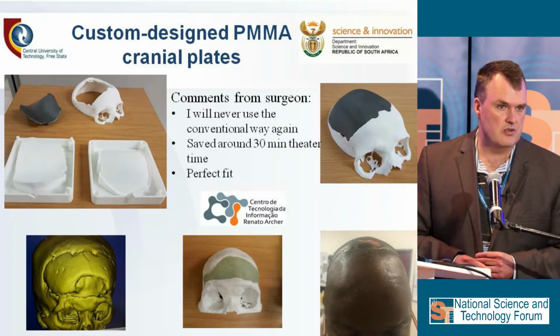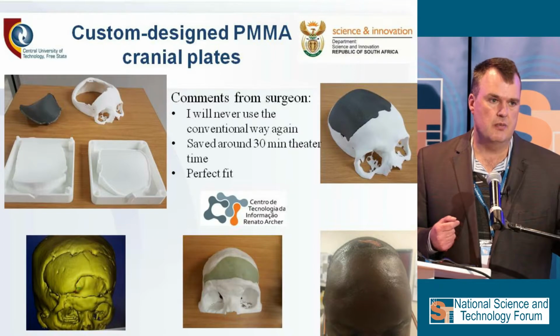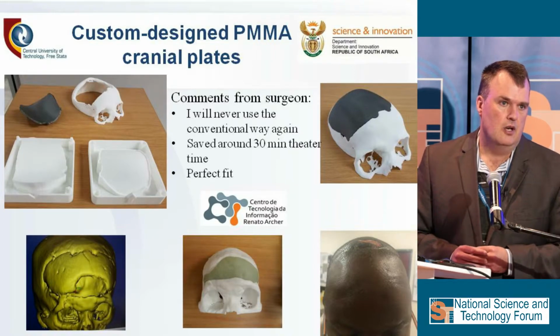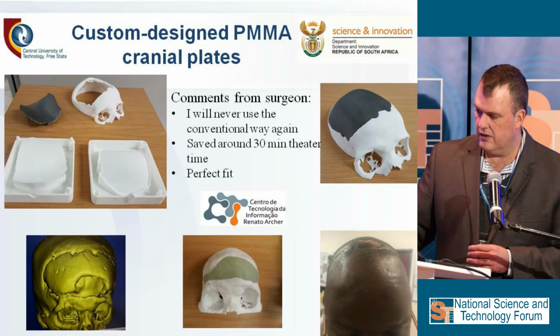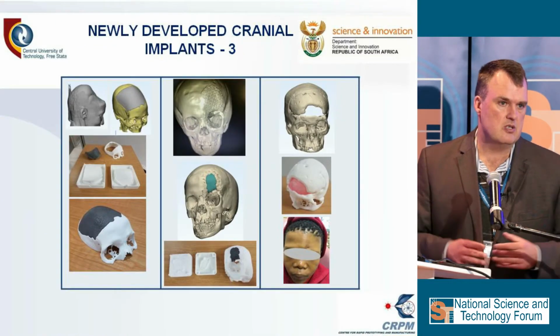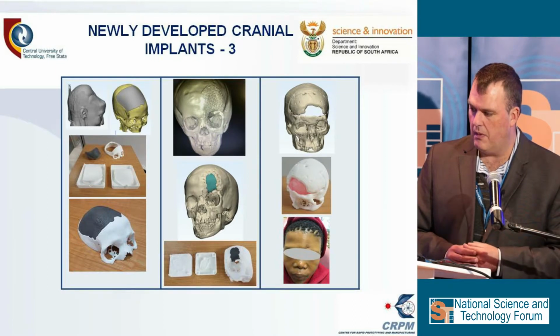a study visit to Brazil, and they print a male and female mold, and they buy the bone cement, take it into theatre, and you manufacture it there in theatre. So we've done that now. Similarly, inside theatre, you could see some of these cases where we can form, if I could say it like that, these PMMA plates.